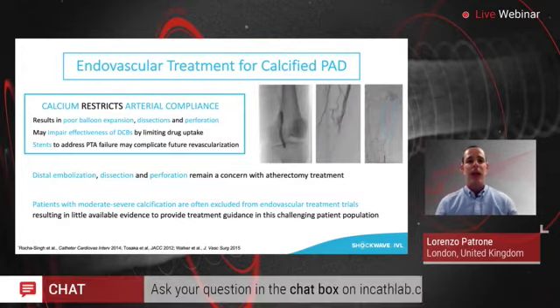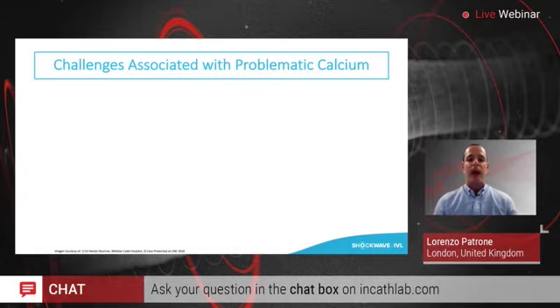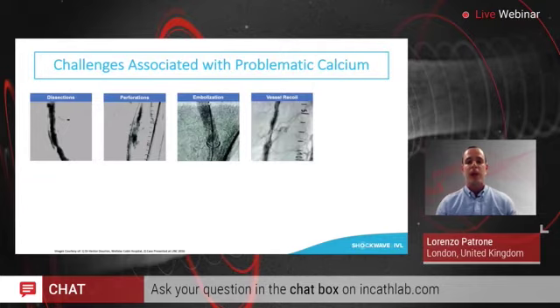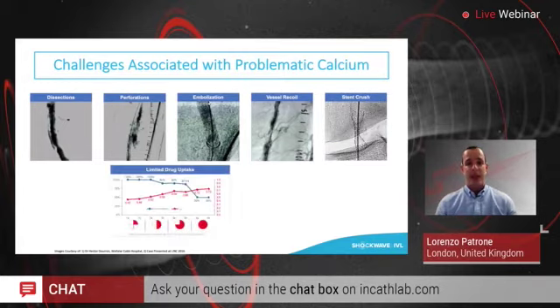This is why I'm so excited today to present this webinar with these experts about the treatment of calcified lesions. When you have very high-level and dense calcification, you can encounter dissection when you do angioplasty. You can encounter perforation, needing covered stents. You can get embolizations, either with angioplasty or when you perform atherectomy. You can have vessel recoil or, even worse, a stent crush. All this comes together with, as we said, limited drug uptake. This is a picture from the famous paper from Fanelli, where the drug is stopped by the calcium and can't reach the media.